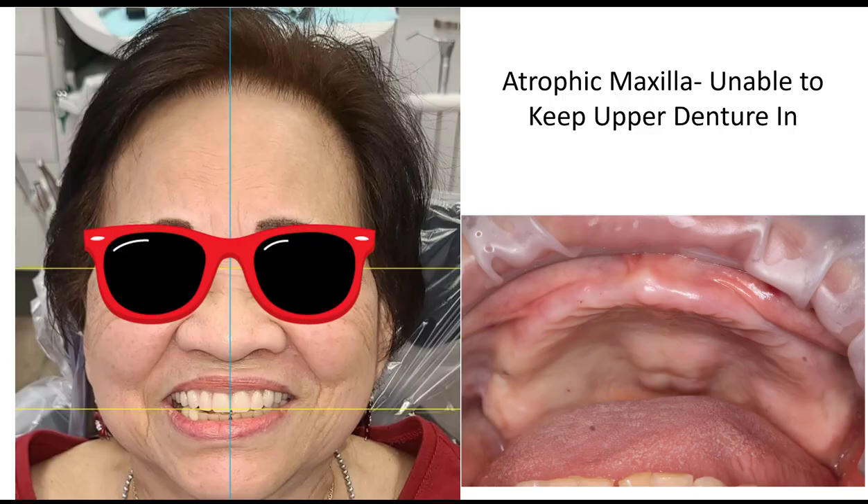All right, so let's jump into this case. This is the patient we worked on, and her main complaint was she's really unable to wear her upper denture. If you look at that ridge on the right image, you can tell why — she's just got a really atrophic ridge. Dr. Gilreath had made her a really nice denture; aesthetically it looks great. She just can't keep it in because she has no bone to retain it.